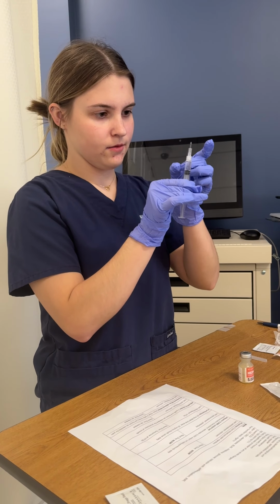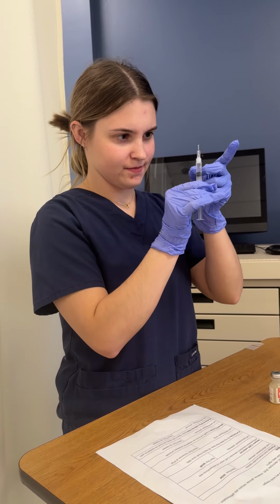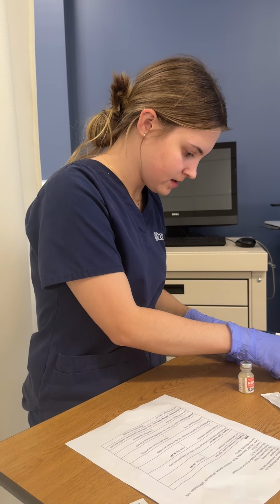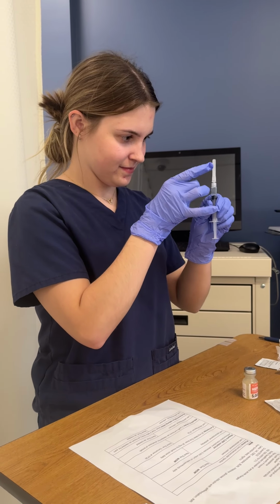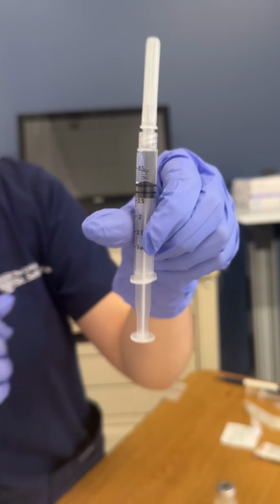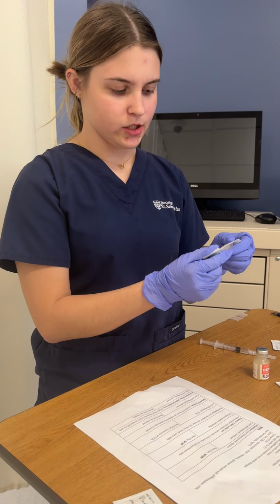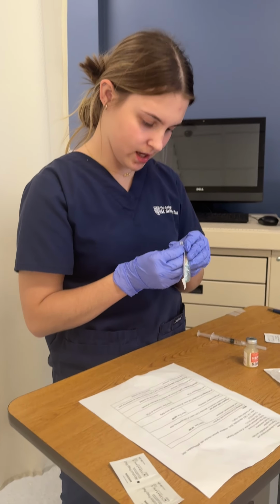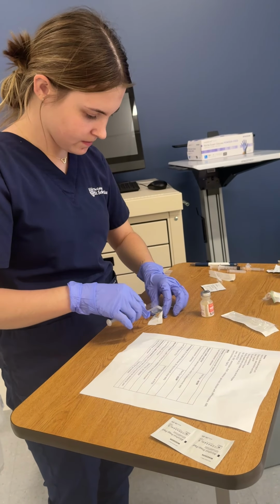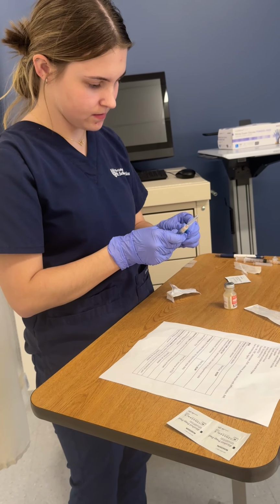We're gonna take that and get rid of any air bubbles that we have here. Okay, and then we are going to recap it. Okay, there we go. And then we have 1 milliliter of solution. So now we're gonna take the 25 gauge by 5/8. We're gonna remove the blunt tip needle. We're gonna put that on and put that here.